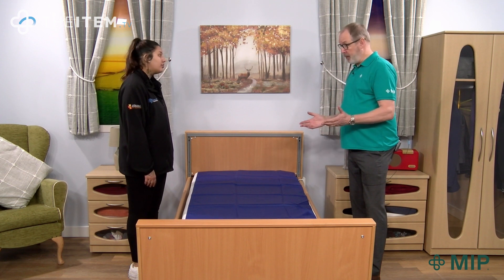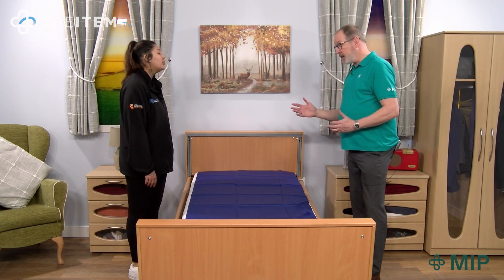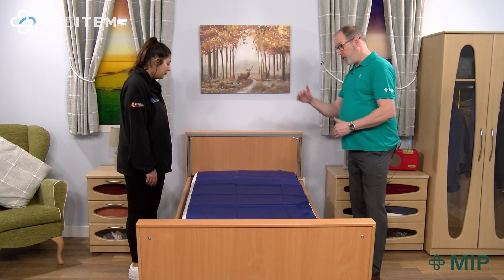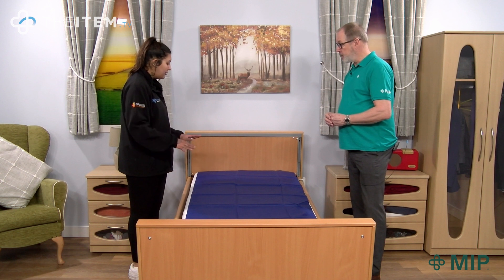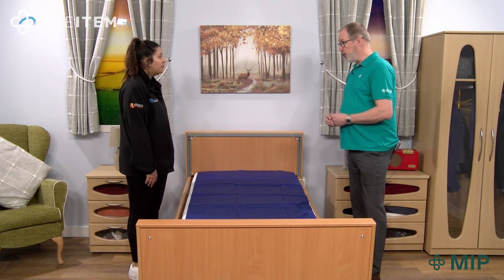It's from Crompton's by MIP. It comes in three sizes: 200 by 85, which you see here today; a wider version which is 200 by 100; and a bariatric version which is 200 by 140 centimetres. With this slide sheet, is there a weight limit? The safe working load is 400 kilograms across all sizes.